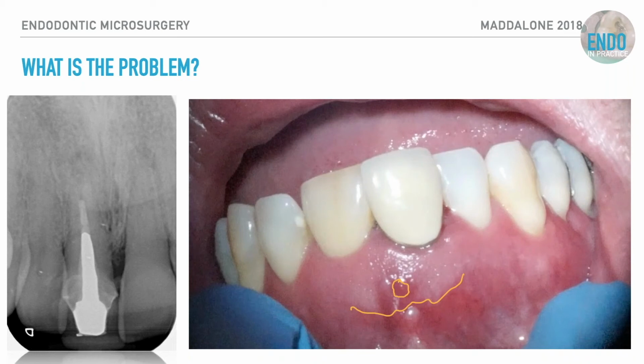The crown itself looks relatively intact. It's a well-fitting crown, albeit there was a little bit of periodontal pocketing on this aspect. Most notably, though, you can see that there's a bit of a slipped contact. So this crown is sitting slightly labial, and you saw me getting the patient to go into protrusion for the occlusal contact of this, and this was the only tooth in protrusion.